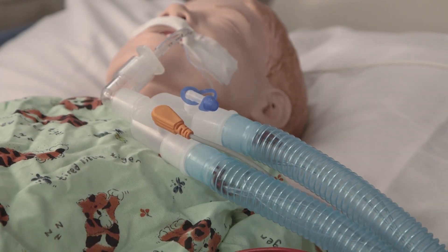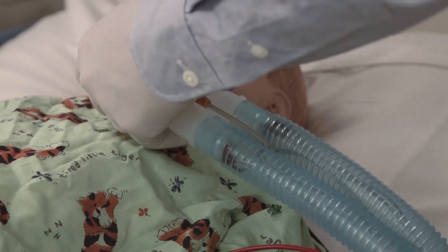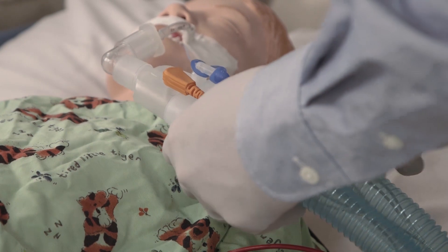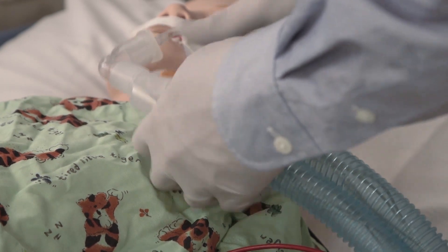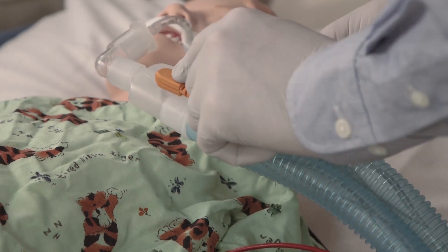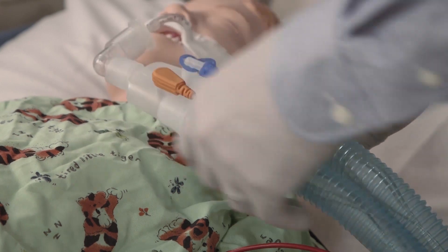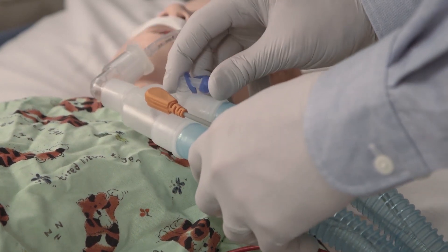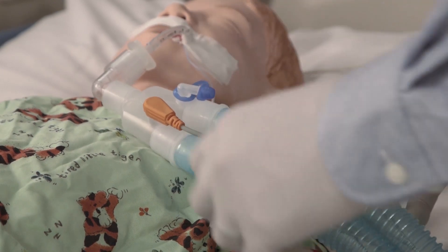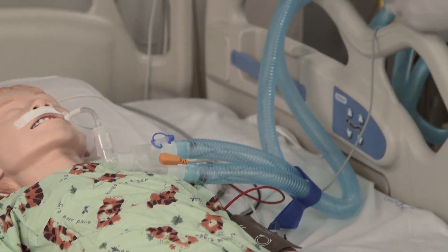Next, we will assess the integrity of our ventilator circuit and its attachment to our patient's endotracheal tube. We want to ensure that it is tightly connected to the endotracheal tube and all fittings at the Y are tightly in place. This is a heated wire circuit, so it has a proximal temp probe closest to the patient at the Y. We need to ensure the cap is on any adjunct pressure monitoring ports and then work our way down the circuit towards the humidifier.